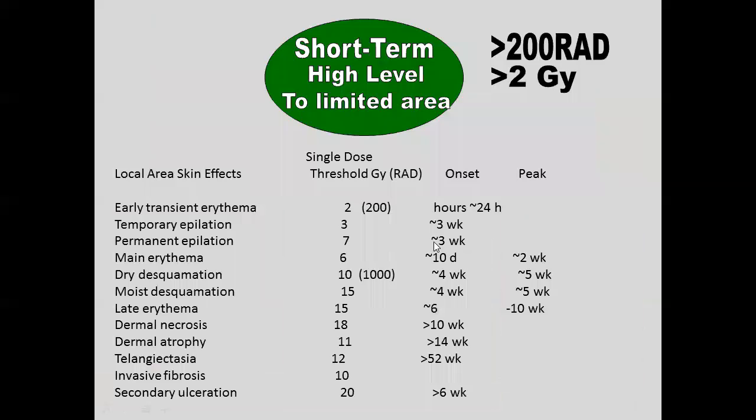The only time we're really going above 7 to 10 gray right now is in our oldest room, because we can't control the pulse rate or the dose rate in that room. It's a 15-year-old lab, first generation digital detector, very unadjustable. That's room 3.